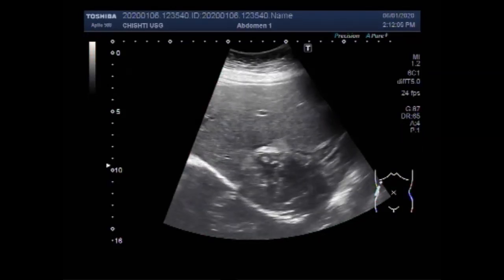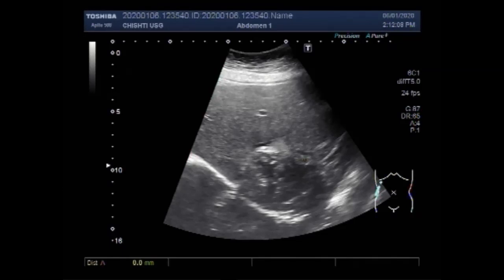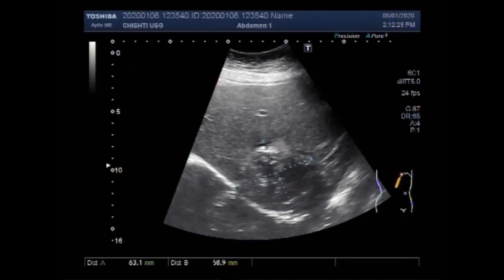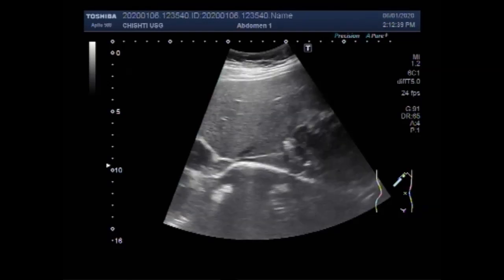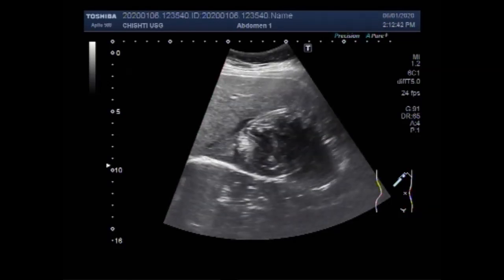You can see the hydatid mass, and it measures in this section about 6.3 x 5.9 cm. The patient will now be examined in the side-down position. Again, you can see the hepatic hydatid mass.